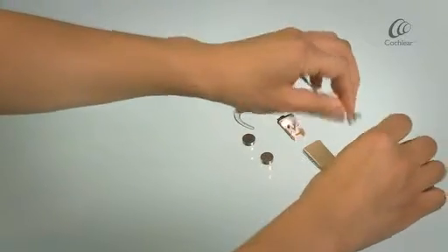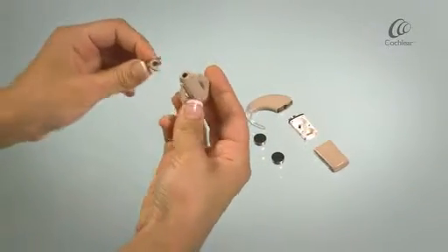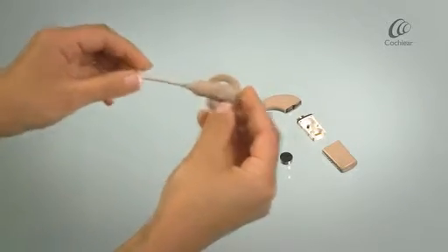Take your coil and coil cable and join them together, like this.